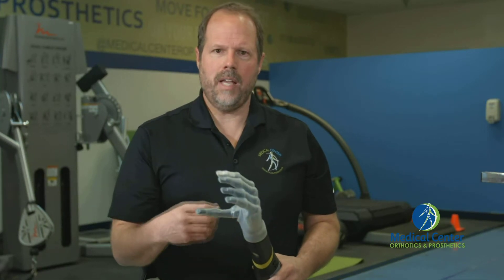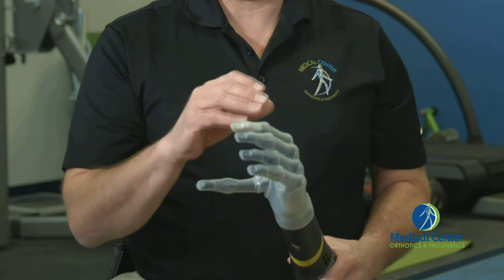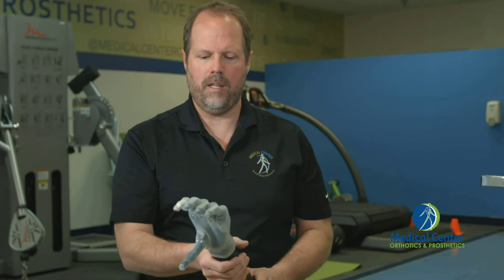Another nice feature about this hand is that the user can download an application on their iPhone and program the hand themselves. They can choose different programmable grasping positions for different tasks, whether they're at work, home, or recreation — they can choose their own grasping position.